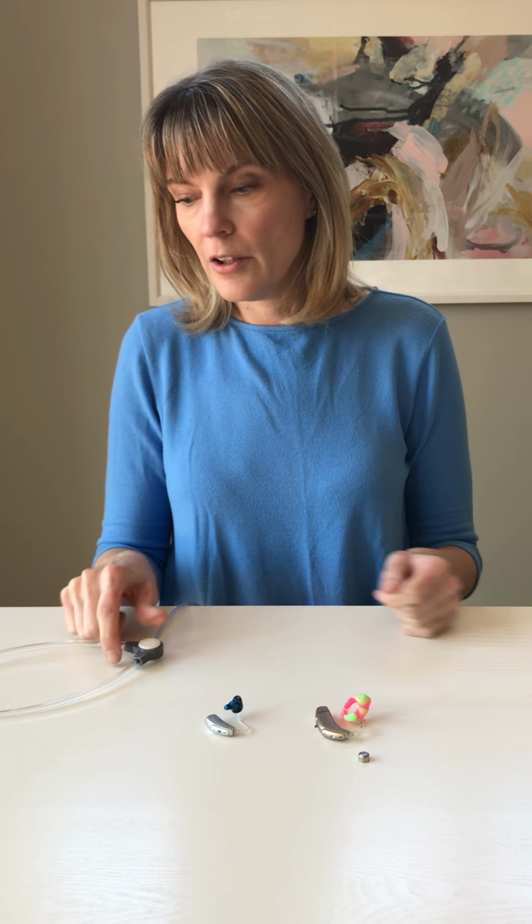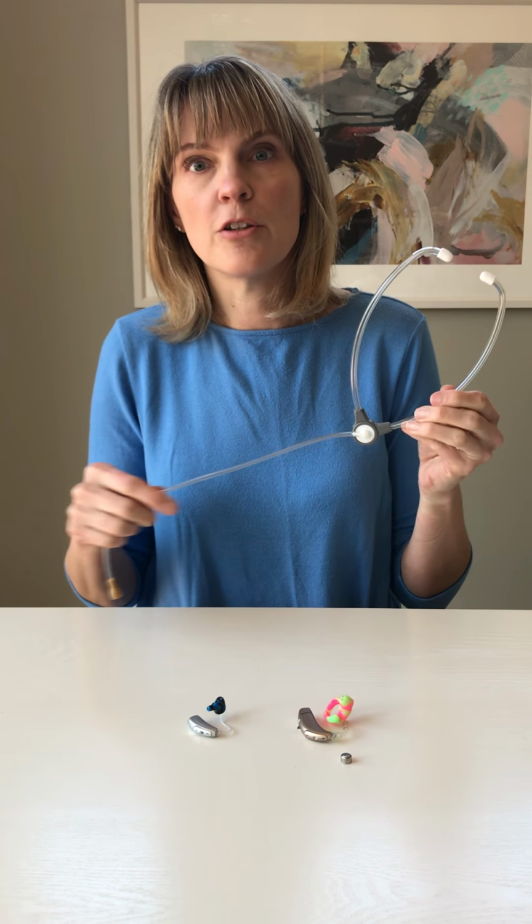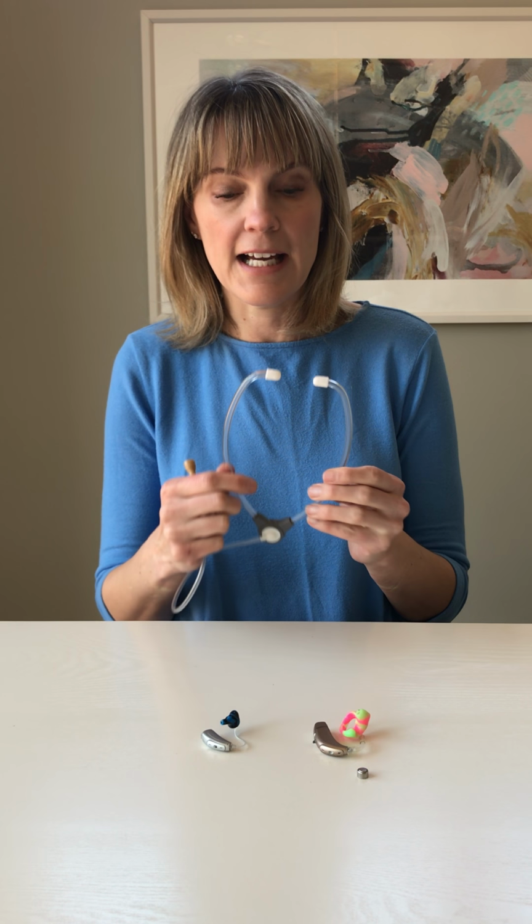Hi, let's take a look at how to troubleshoot a hearing aid that either sounds like it's not working at all or sounds like it's too soft. Hopefully at home you have a listening tube, and the listening tube is super helpful because it allows you to do either a daily or a weekly listening check of your child's hearing aid so that you have an idea of what it should sound like most of the time.